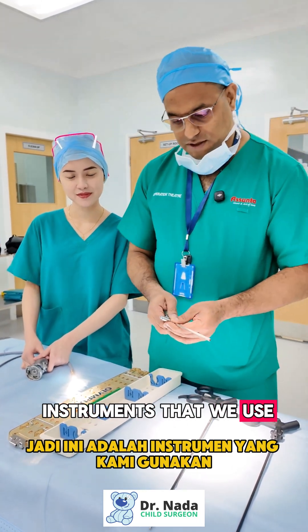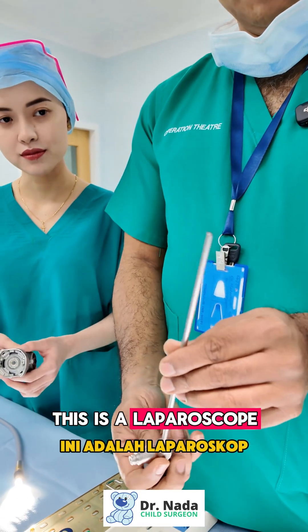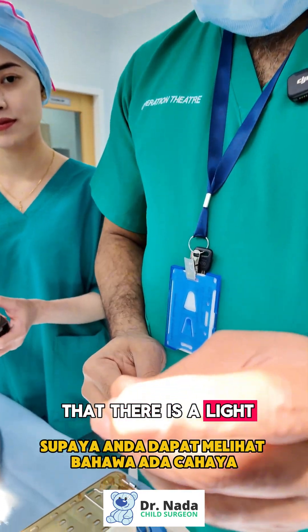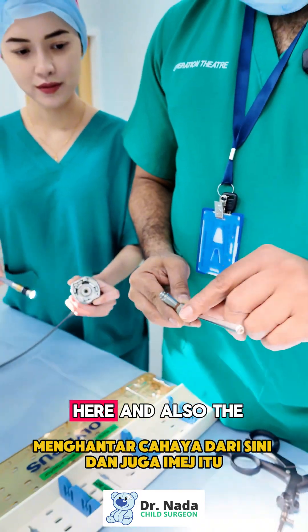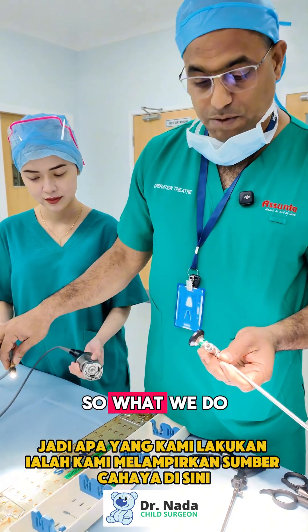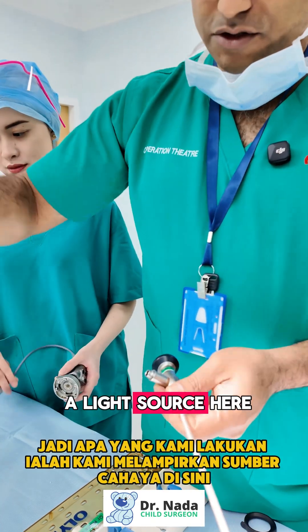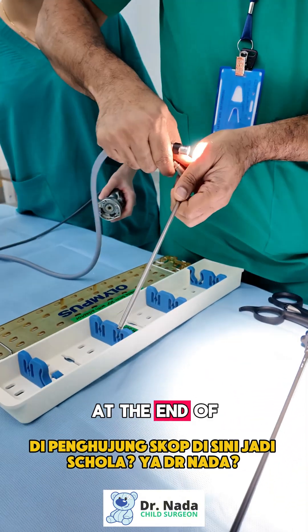These are the instruments we use inside to see what's happening. This is a laparoscope — there's a light channel here so we can transmit light, and the image also comes through this. We attach a light source here, and you can see light at the end of the scope.